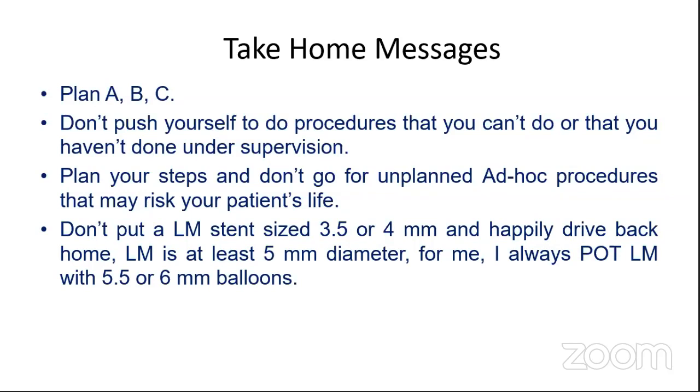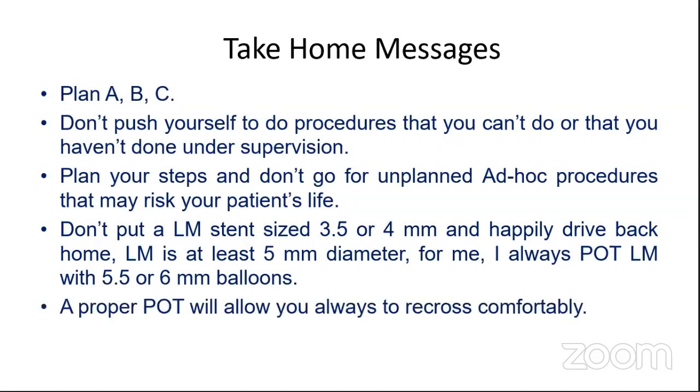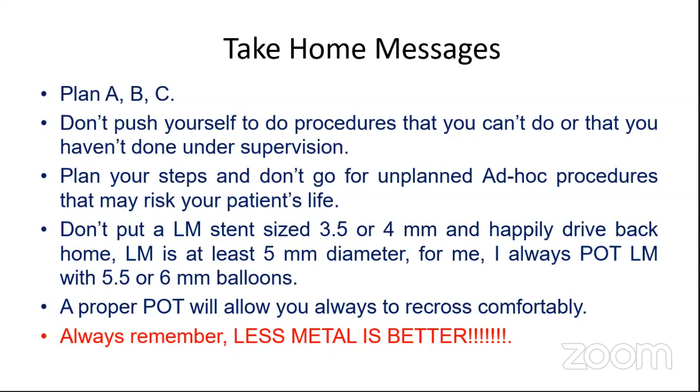Do not put a stent in the left main that is 3.5 or 4 millimeters and happily drive back home. The IVUS studies showed us that 85% of the left mains are 5 millimeter, 5.5 or 6 millimeter. For me, I always POT the left main with my favorite 5.5 by 12 or 6 by 12 millimeter balloons. A proper POT will always allow you to recross comfortably to the side branch if you cannot pass properly. And always remember again, the less the metal, the better is the long-term outcome. Thank you so much, Karim, Haysem, Ahmed, and Abdelrahman, for moderating this case.